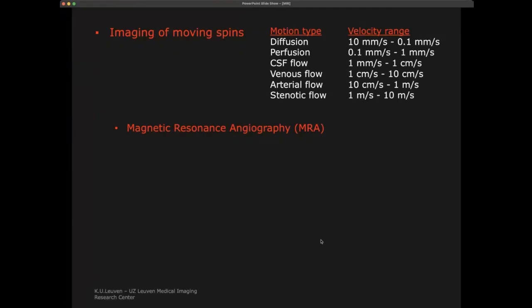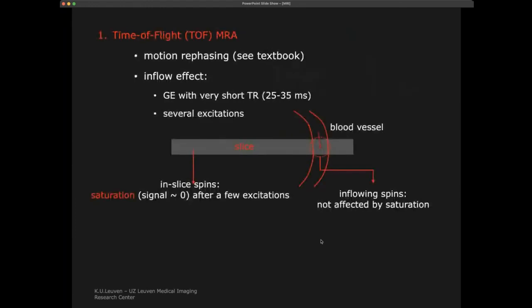While we're doing the imaging, the tissue in the image, which is the blood, is changing, because blood moves out of the slice that we have selected and new blood can move in. And we can use this fact that blood is moving. Each time we have different blood coming into the voxel we're looking at, we can use that to specifically image the blood, to do angiography.